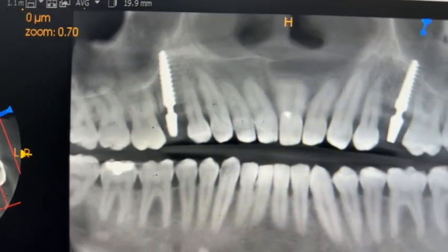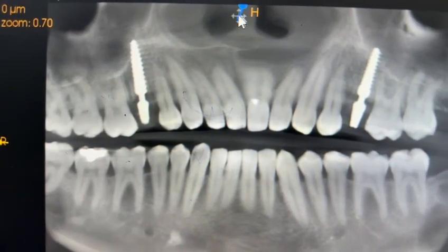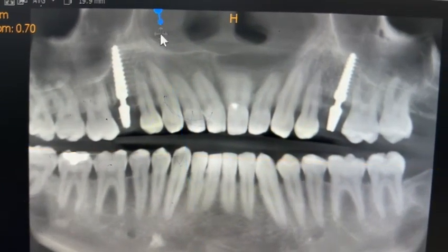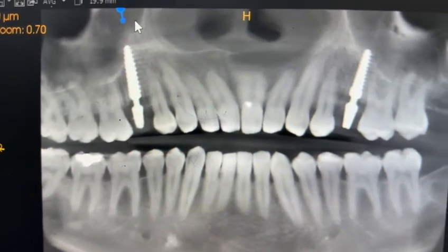This is the right side, almost similar. This is also getting engagement from the sinus floor.